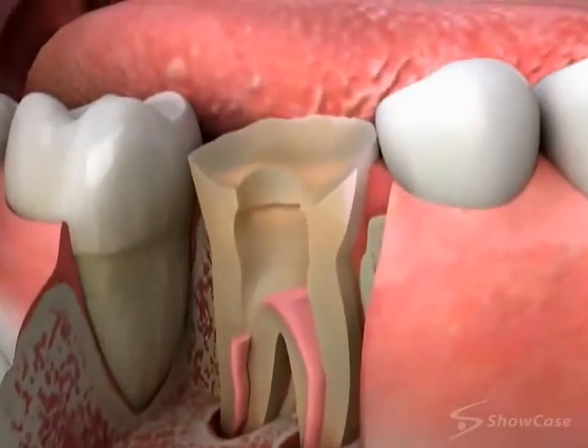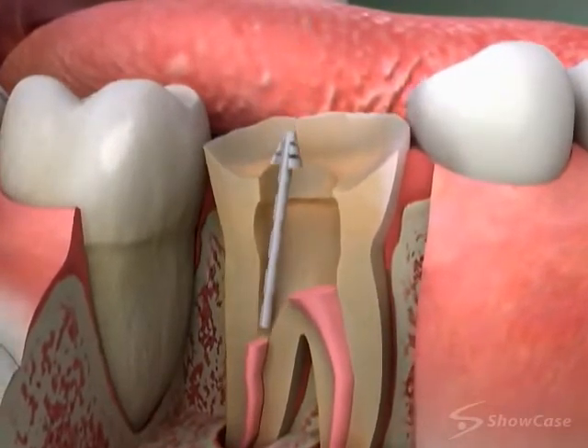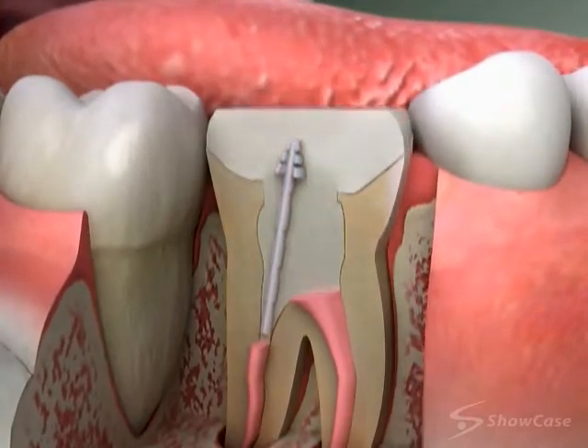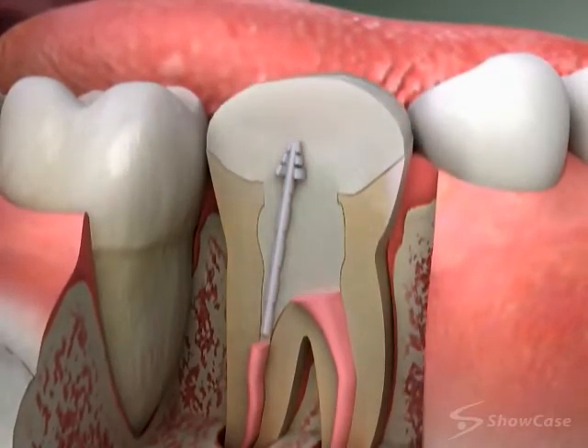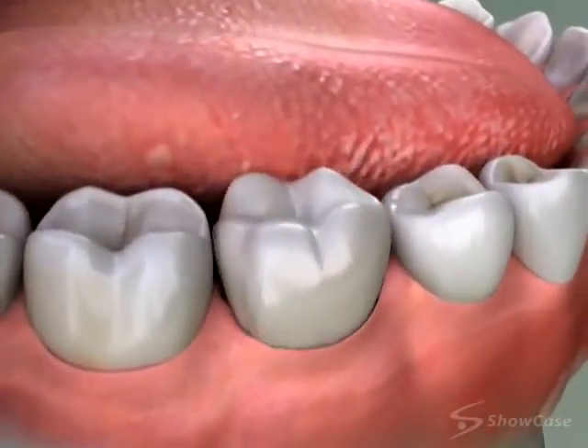First, we prepare a space for the post in one of the root canals. We try in the post and then cement or bond it in place. Next, we place the new core material on the tooth. Lastly, we shape the material to accept the crown.